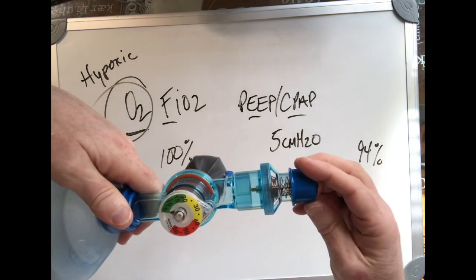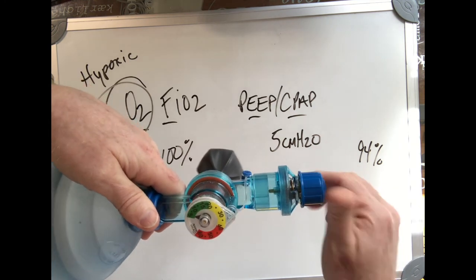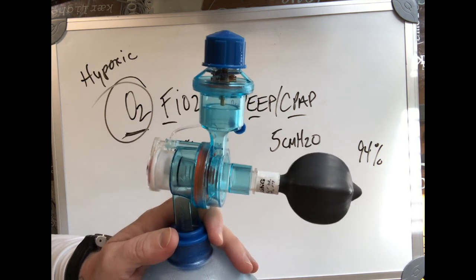If I need to dial that PEEP up, my CPAP up, I can go as high as 20, and you can see here that that makes the lung even more recruited. Super important concept to understand.